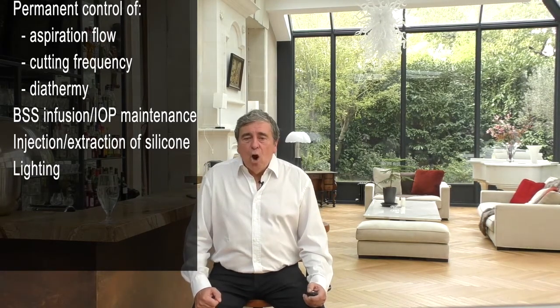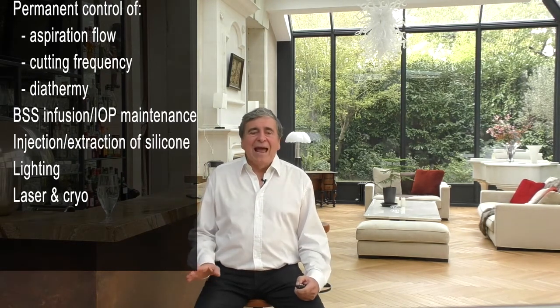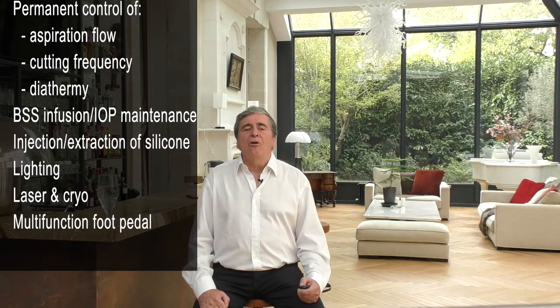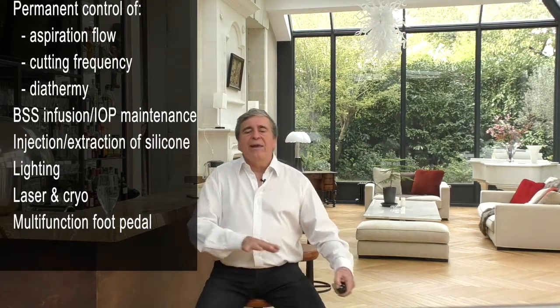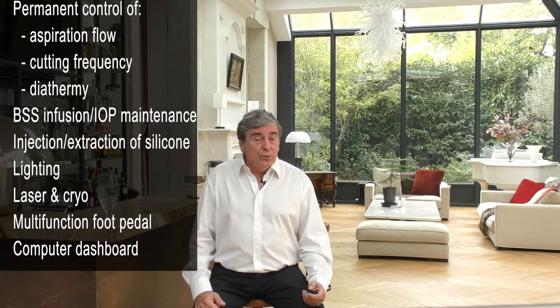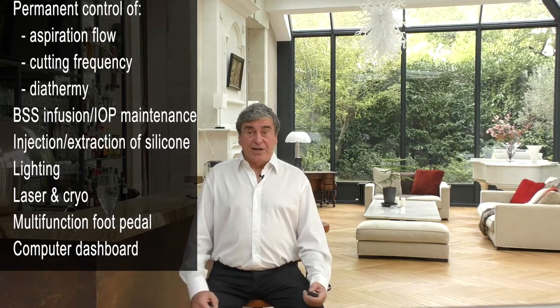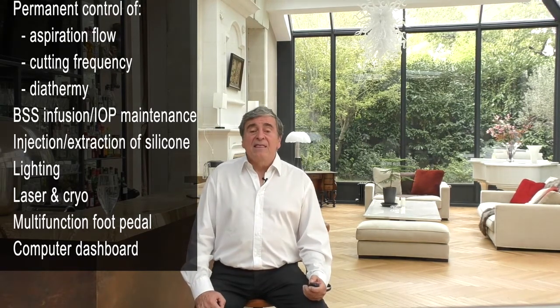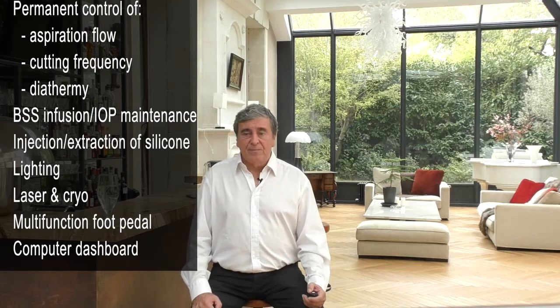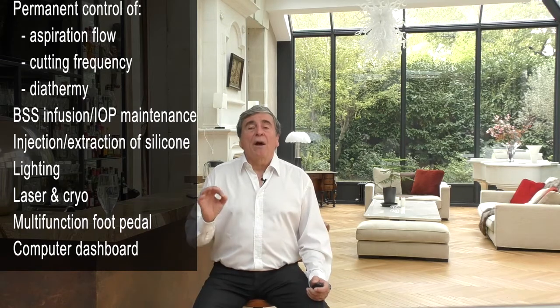We need a low toxicity lighting system and, if possible, a laser and a cryo whose control could be managed with the same foot pedal to avoid having to play on several pedals like an organist. Finally, we need a computer control system that allows us to customize programs for each operator. I believe that each of us would sign these specifications without restrictions, but let's see now in detail, point by point, what it means.